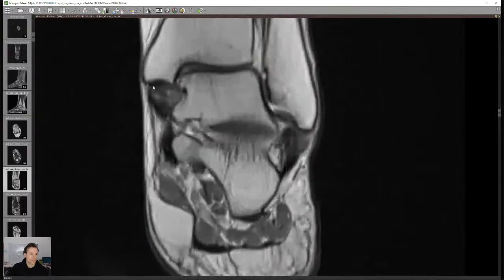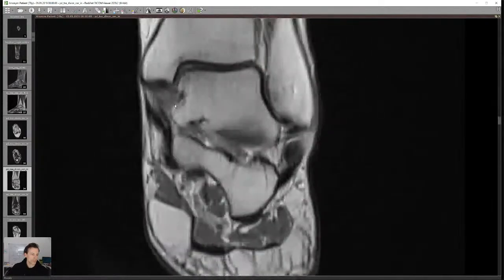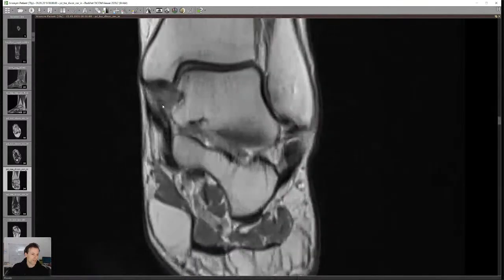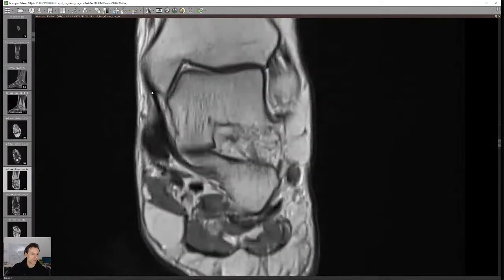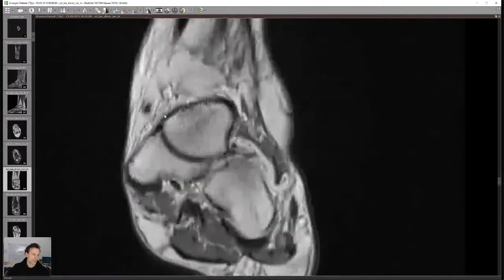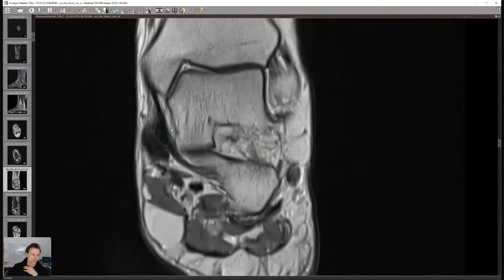Once done with the lateral ligaments, you assess the medial ligaments — you want to see nice striation, which is not the case here as they are a little scarred after all the trauma. There's a deep portion and a superficial portion — the posterior tibio-calcaneal ligament, tibio-spring ligament, and anteriorly the tibionavicular ligament, which is not easy to see anyway. Next, also mention the spring ligament complex, which we've already covered.